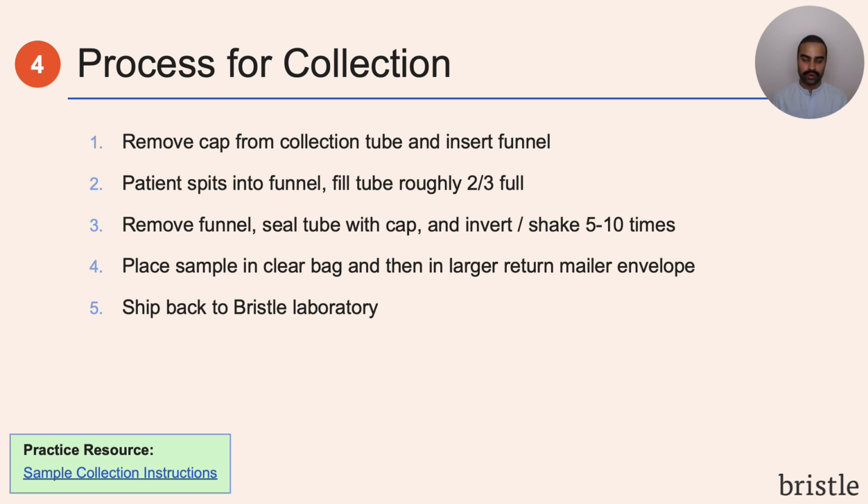Then you remove the funnel, screw the cap back onto the tube, and then shake or invert it 5 to 10 times. Then you place the collection tube in the clear sample bag, put it back in the return mailer, and ship it to the lab for processing. And each kit comes with a detailed instruction guide that goes through these various steps.